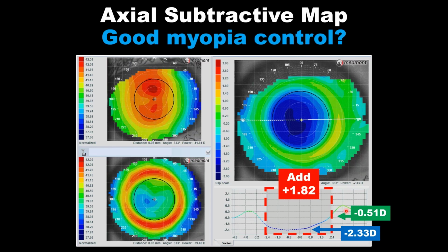So if we're trying for myopia control, we know experts like Earl Smith III at the University of Houston tell us to push the most plus that's possible, push the most plus that the patient can manage before the aberrations become bothersome and you need to back them off. In such a case, we want to ensure that we have pushed as much plus in this orthokeratology effect as we can. And 1.82 diopters would be considered reasonable, but is it meeting that ideal 2.5 to 3 diopter range that we might really desire or really have confidence that we're doing a good myopia controlling outcome?